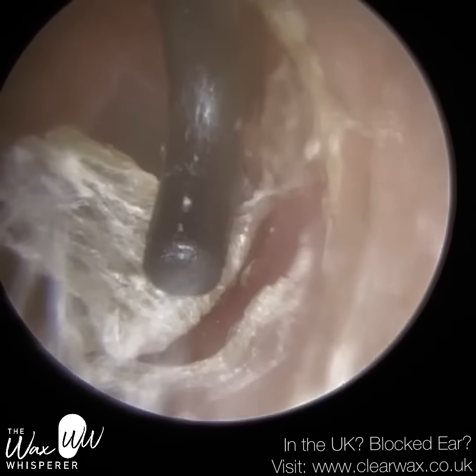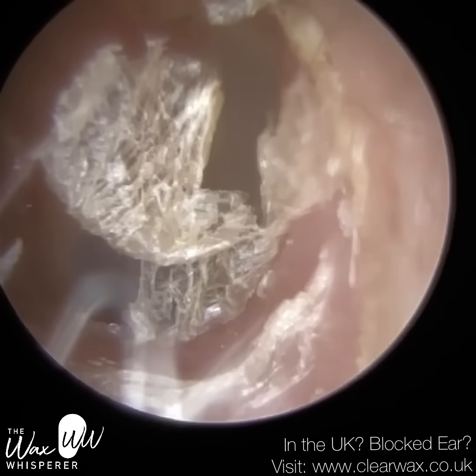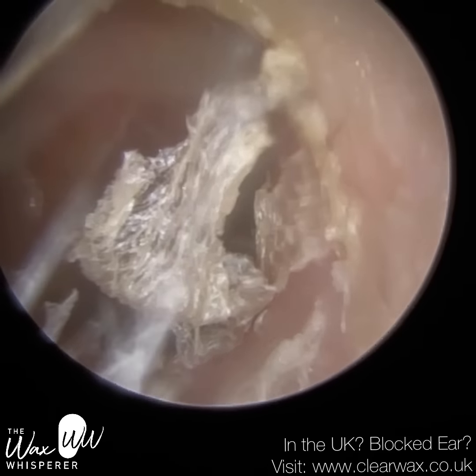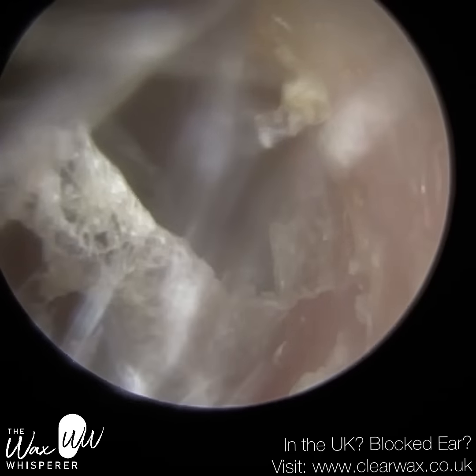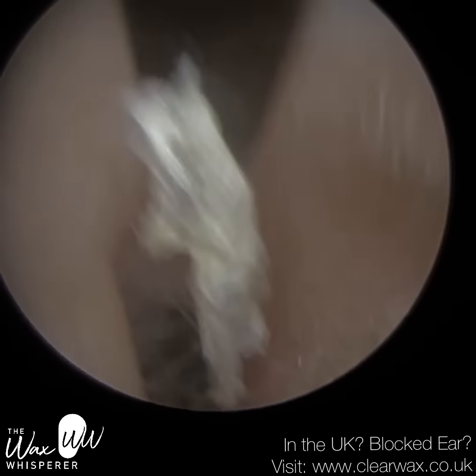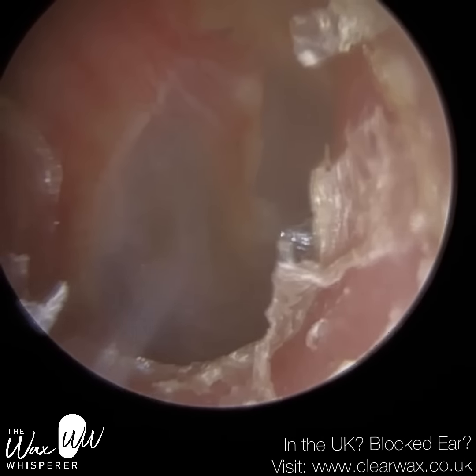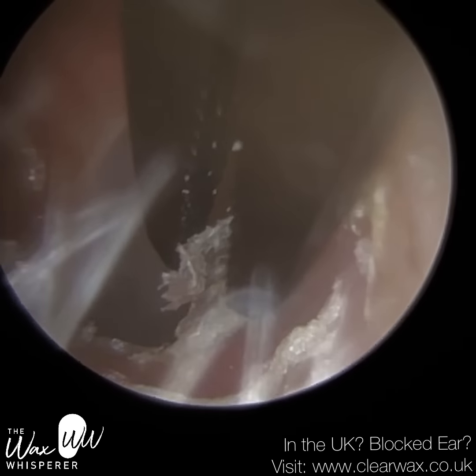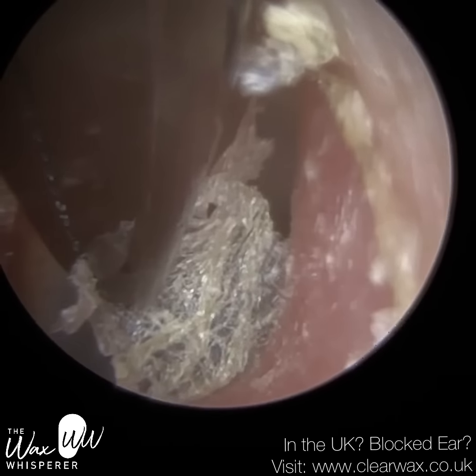So you can see this piece of skin here. I'm just initially using the hook to position the skin to allow me to use the forceps to get some purchase, get some grip. And I've just attached the forceps, the jaws either side of the skin. There's still a bit left at the base. We're on the bony part of the ear canal. This is a sensitive region, so I'm just slowly gliding that bottom jaw underneath, lifting it up, getting another grip.